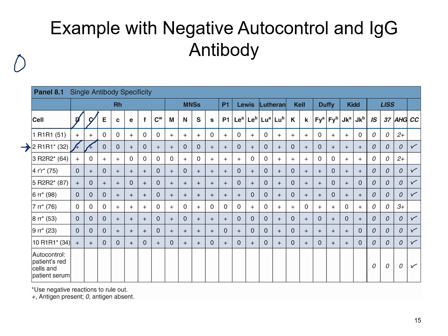Now we're looking at little c, it's not present. Little e is homozygous little e. So we know that if the patient had an anti-little e, they should have agglutinated here, and they did not. We're ruling out. All right, let's look for our next antigen that's present, which is Cw. We can rule that out.